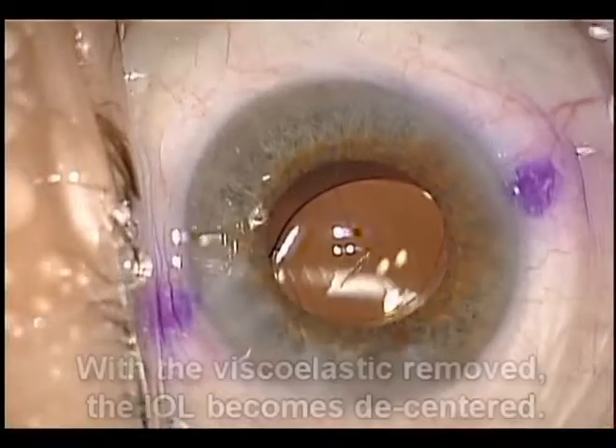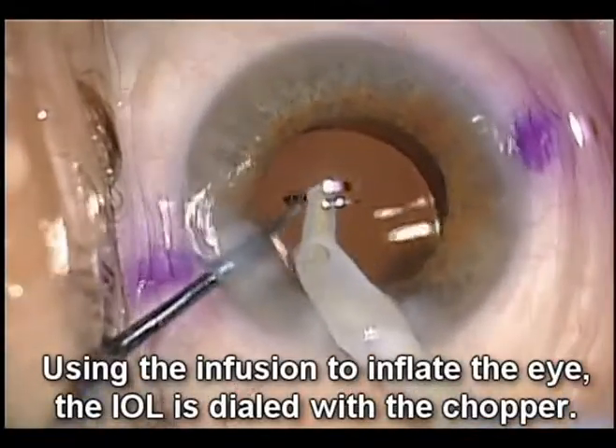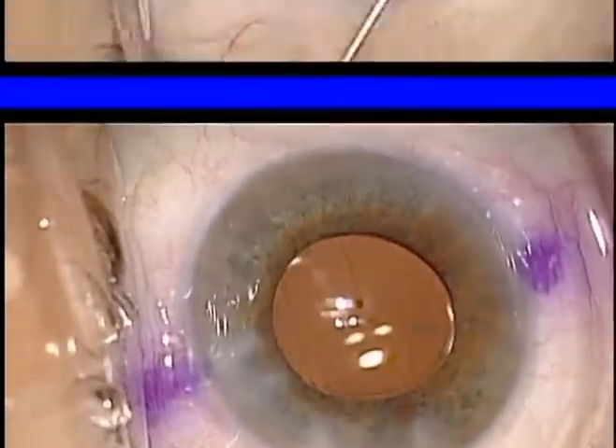What's going on here? Using infusion to inflate the eye, we try to rotate the lens, hoping for more stability. But yet, when we come out of the eye, we note that it de-centers again.